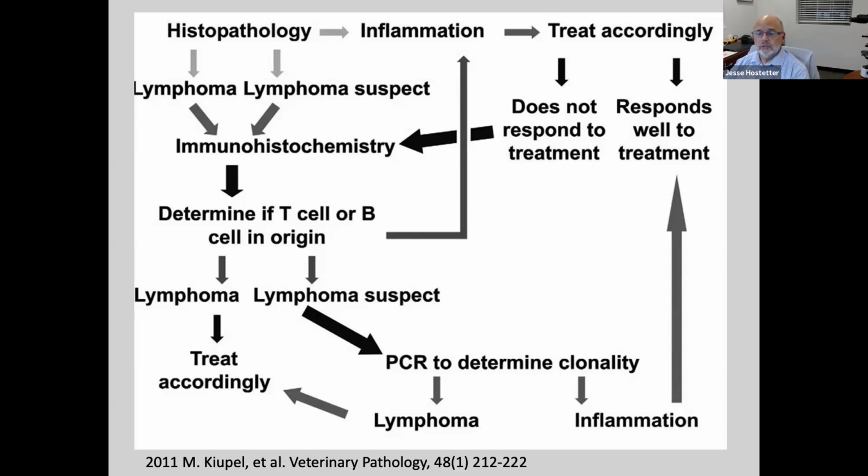I've got a 17-year-old cat, chronic constipation, vomiting, biopsy shows CD3 lymphocyte infiltrates in mucosa, submucosa, and also surrounding plexus ganglion cells, but not prominent in the muscle layer. It's a type of small cell lymphoma with neurotropism, never seen it before. I have not seen that before either.